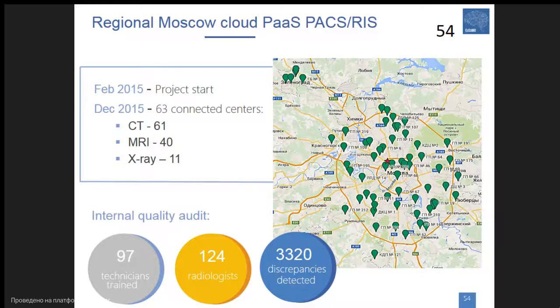Currently, we are connecting also clinicians to the system. And the United Radiology Information System allows for quality control and for detection of discrepancies in the reports.